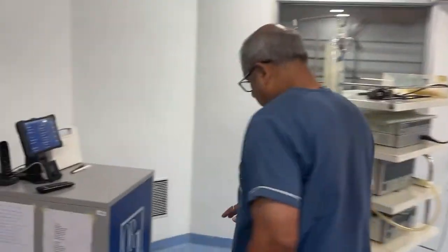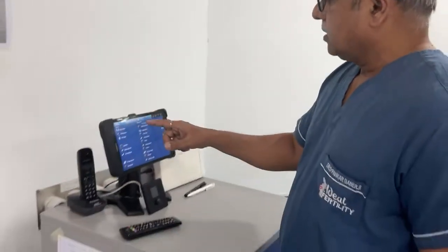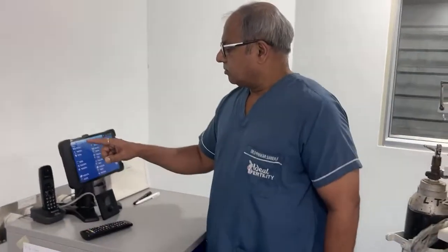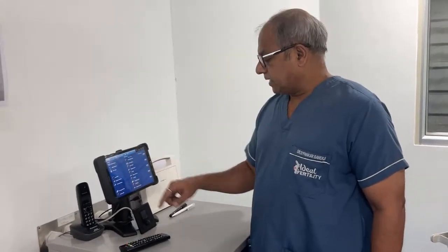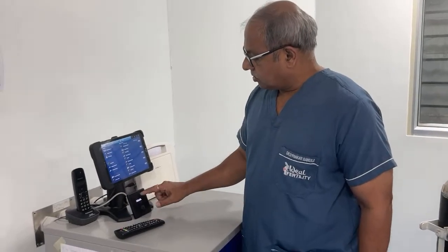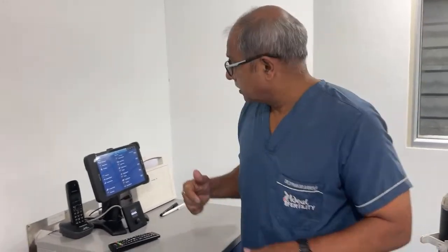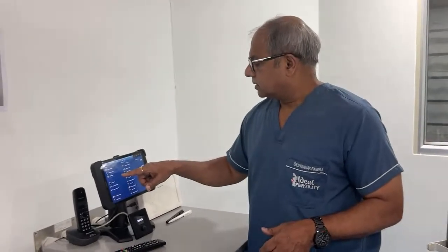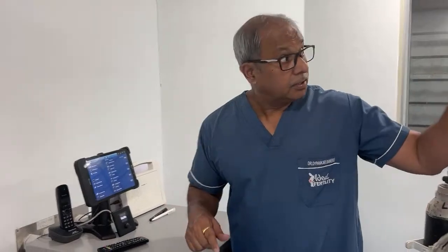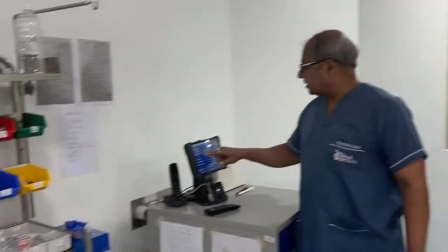The system is called OR1 through Karl Storz, and this is the OR1 system's main console where we can control things: one is source, one is destination. This is video, and through this we can have audio also, and we have a mic so we can talk to our auditorium also. And if we want to show something else on that screen, we can decide that.